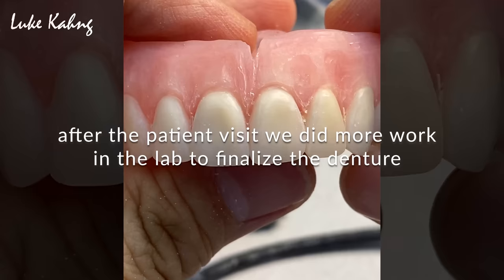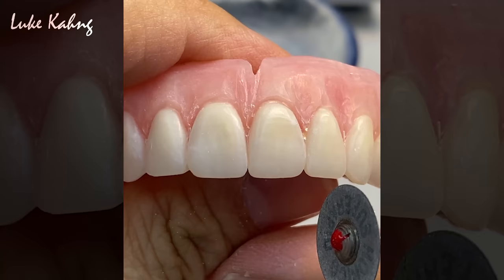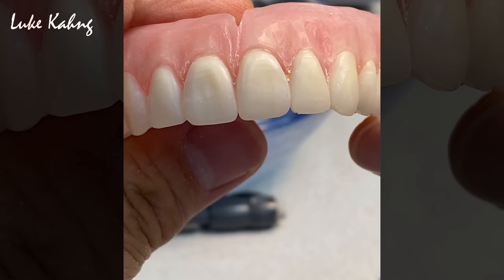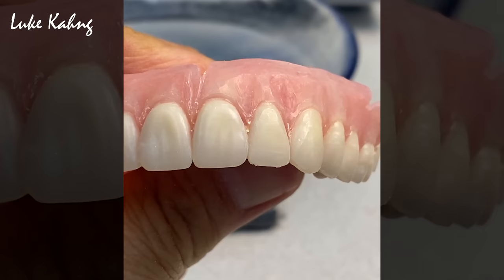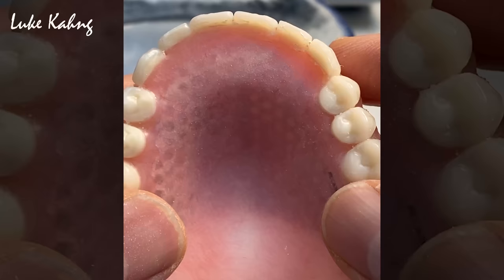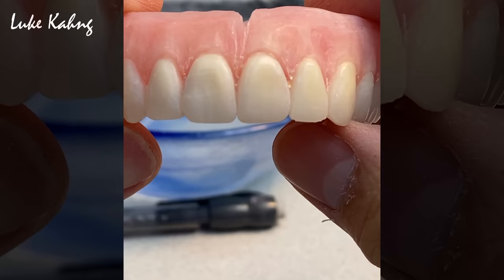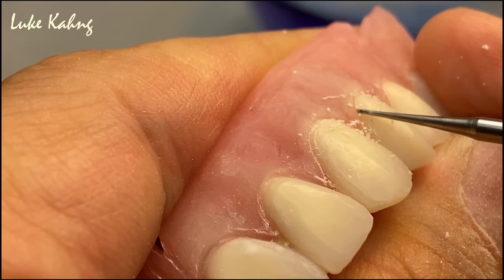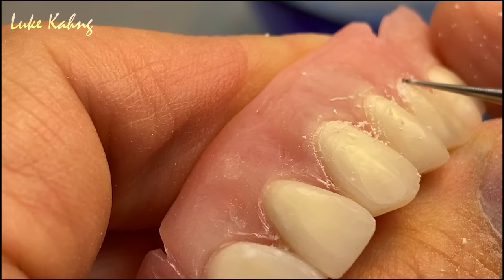Just a little bit of fine detail tuning. I have to process very tiny. First, we made a little trim here, it's totally great. K9 is flat, which is the patient's ones. Yes, I'm going to make a little bit of a groove here. Otherwise, it's nice aesthetics. So it's a little bit more special. So we separated between the denture teeth and tissue. So the total cover is there.